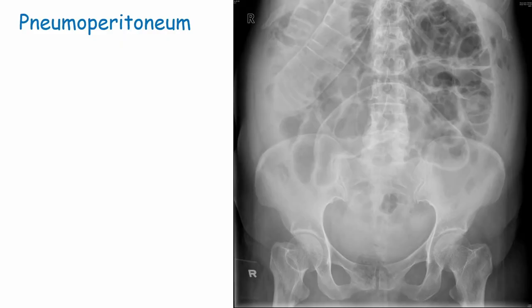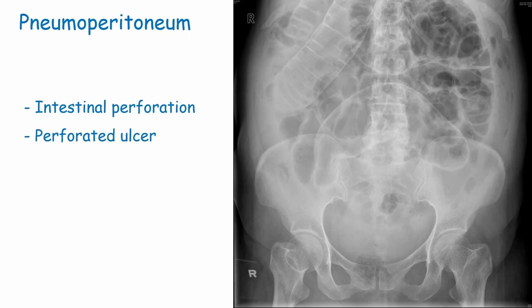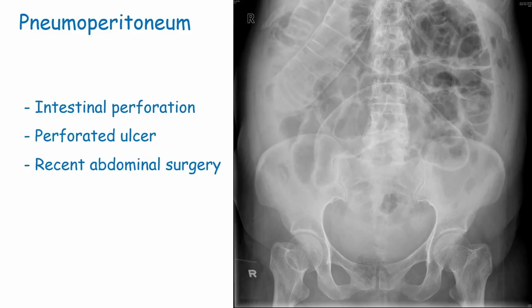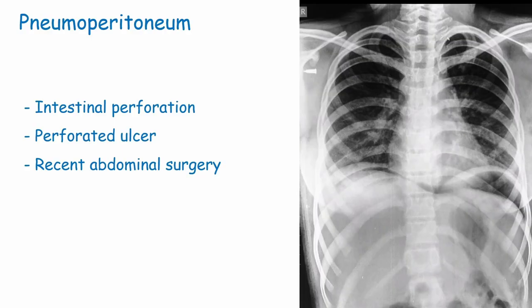Pneumoperitoneum means free air in the peritoneal cavity. This is not good and can result from intestinal perforation or a perforated ulcer in the bowel. It is less worrying in the context of recent abdominal surgery, where air introduced through a peritoneal incision is generally self-limiting. On x-ray, Rigler's sign - also known as the double wall sign - indicates that both sides of the bowel wall are visible, which only occurs when there is air both inside the bowel and surrounding it. An erect chest x-ray is also useful, as air will rise to the top of the abdomen and be visible beneath the diaphragm.